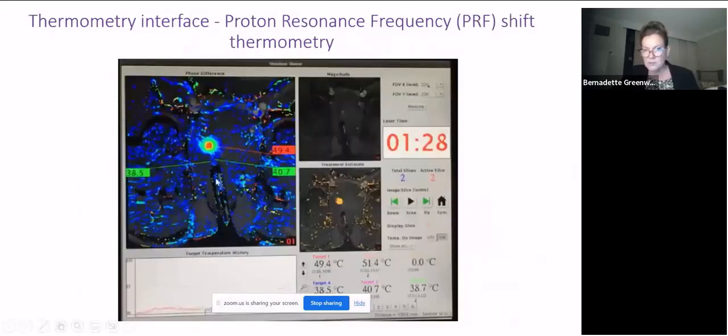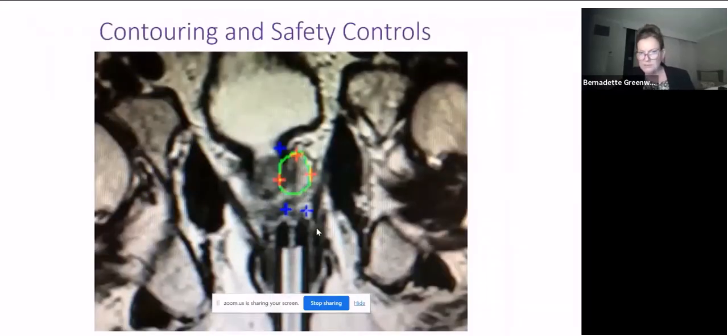As the patient is being treated, you could see the endorectal needle guide is there, the fiber's inserted. When we turn on the laser, there's a graph that measures temperature change over the course of time, anatomic images that show us what's being affected by the energy we're depositing, and then a cumulative representation of anything that exceeded 60 degrees Celsius. So dead tissue is represented by these little orange blobs. Now all this extraneous stuff out here is just noise, motion, things that don't matter. The fiber is here. The fiber is not over here. So all these little things are just blood vessels and muscle twitches and stuff like that. The beauty of the technique that we use is we're able to contour to the area that we want to destroy, and we put little borders around what we don't want to destroy.